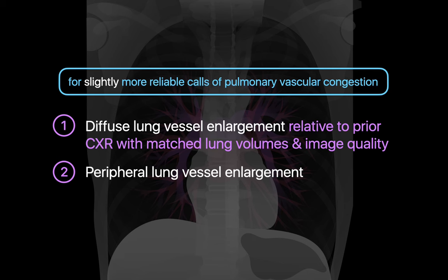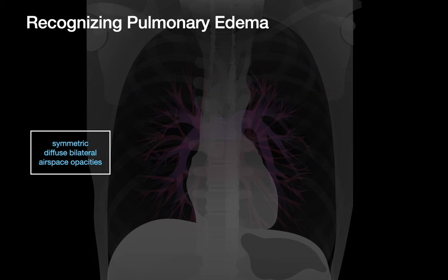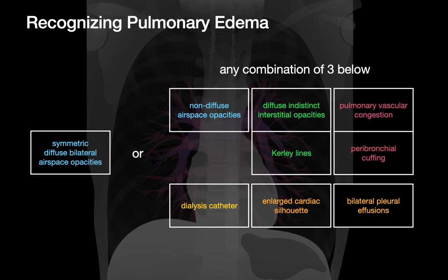Although these rules will help a little, you'll probably still need to incorporate more imaging signal to diagnose pulmonary edema well on a chest x-ray. Consider calling pulmonary edema only in the presence of either symmetric diffuse bilateral consolidation, or when any three of these eight features are present: non-diffuse consolidation, diffuse indistinct interstitial opacities, Kerley lines, pulmonary vascular congestion, peribronchial cuffing, a dialysis catheter, an enlarged cardiac silhouette, or bilateral pleural effusions.